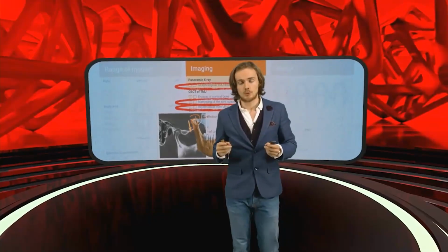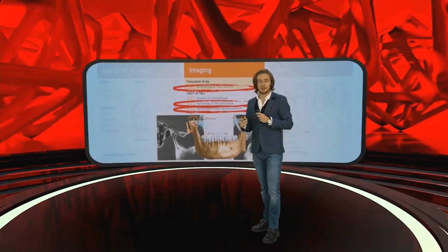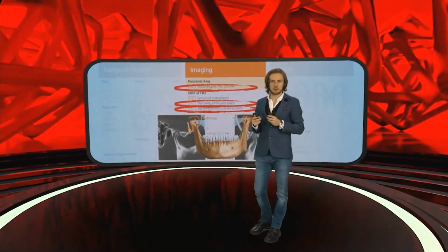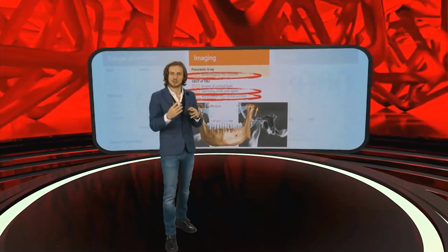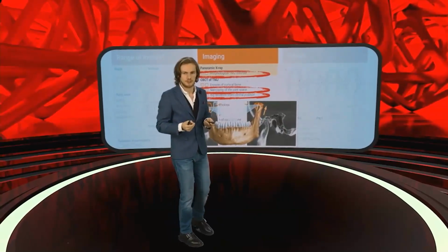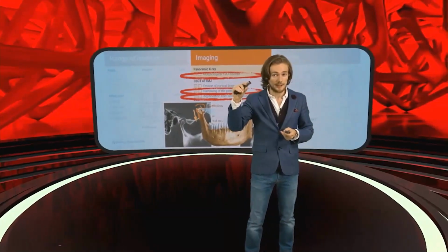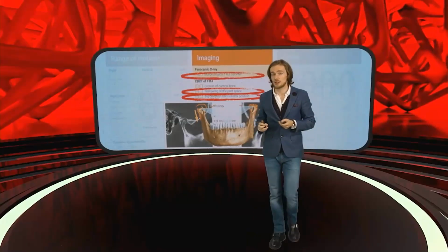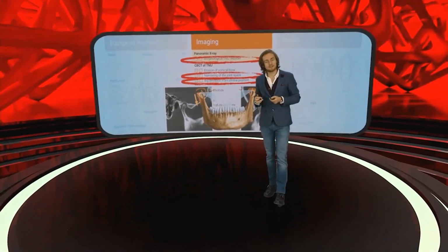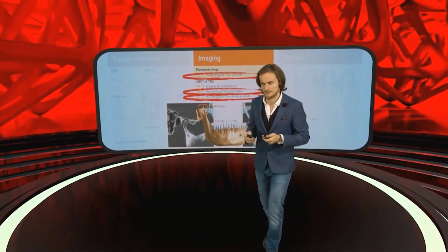Okay, what we've already spoken about was the panoramic morphology, panoramic disorders, what you can see on the panoramic X-ray, and what are the limitations of the panoramic X-ray, and every single 2D picture with some overlapping structures that may make you very, very confused. What we already talked about is the joint space in the CBCT, we know how much we need for our disc. So we already know what is too wide space and what is too narrow space.